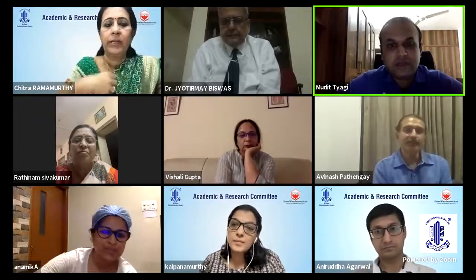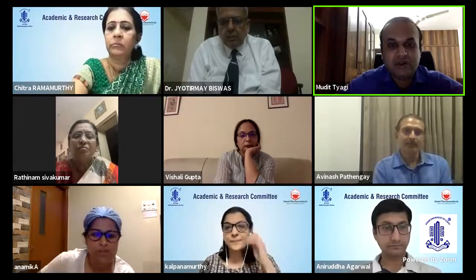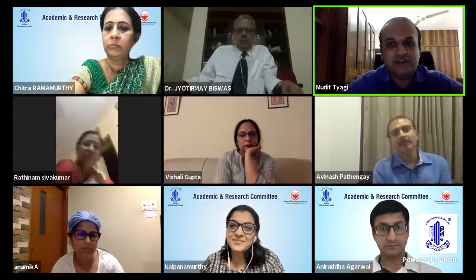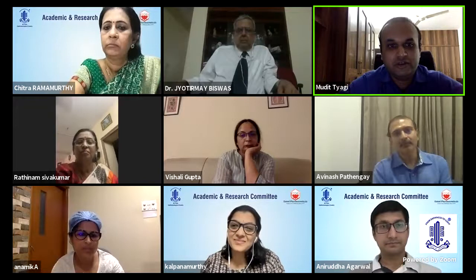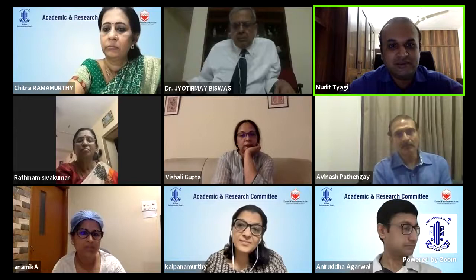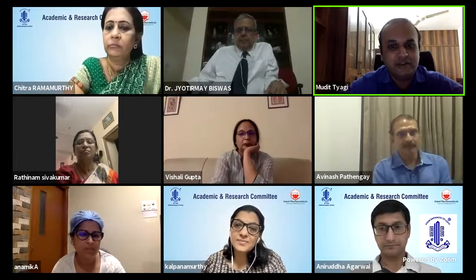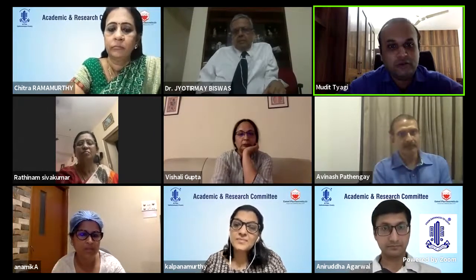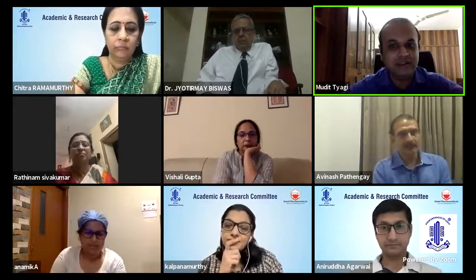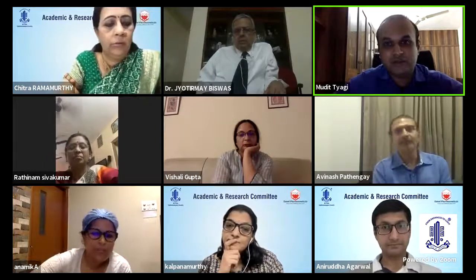Thank you, Anamika. Those were great cases, and I think maybe wide field angiography does add more to our knowledge. It's probably making us realize a lot of other things which till now we had never explored. Like what you had shown in your cases, while at this point of time it may not be very significant in terms of making a clinical decision, it does add to our knowledge. And there is definitely, like what Dr. Avinash said, a paucity of literature. So we still need to explore more the role of wide field angiography in these entities, which till now we have not done in as much detail as we can in future. So thanks for those great cases. And maybe we can now move on to the next speaker, please.